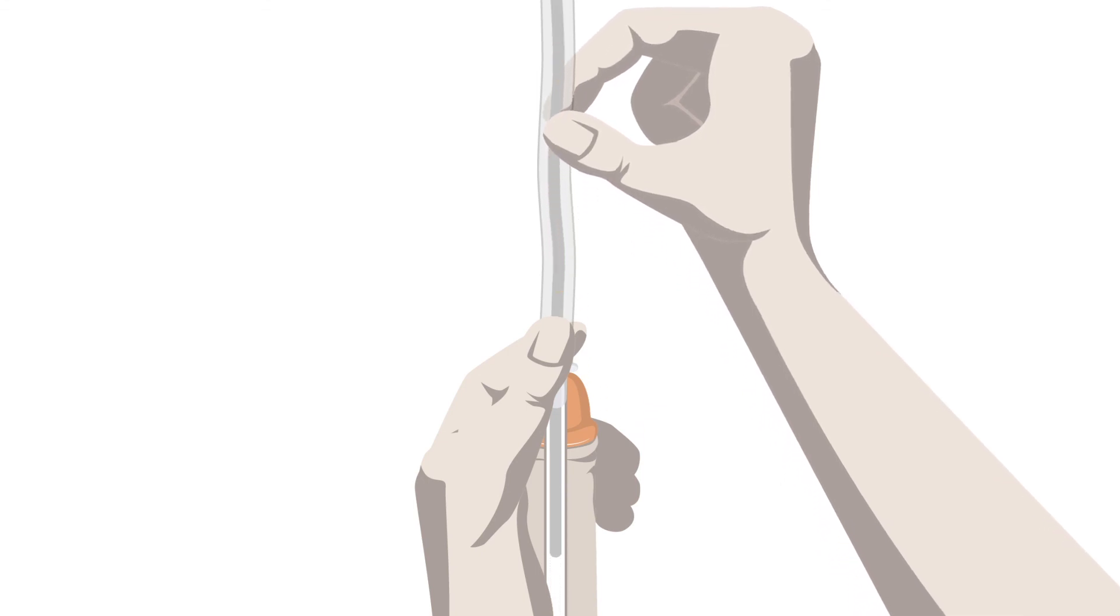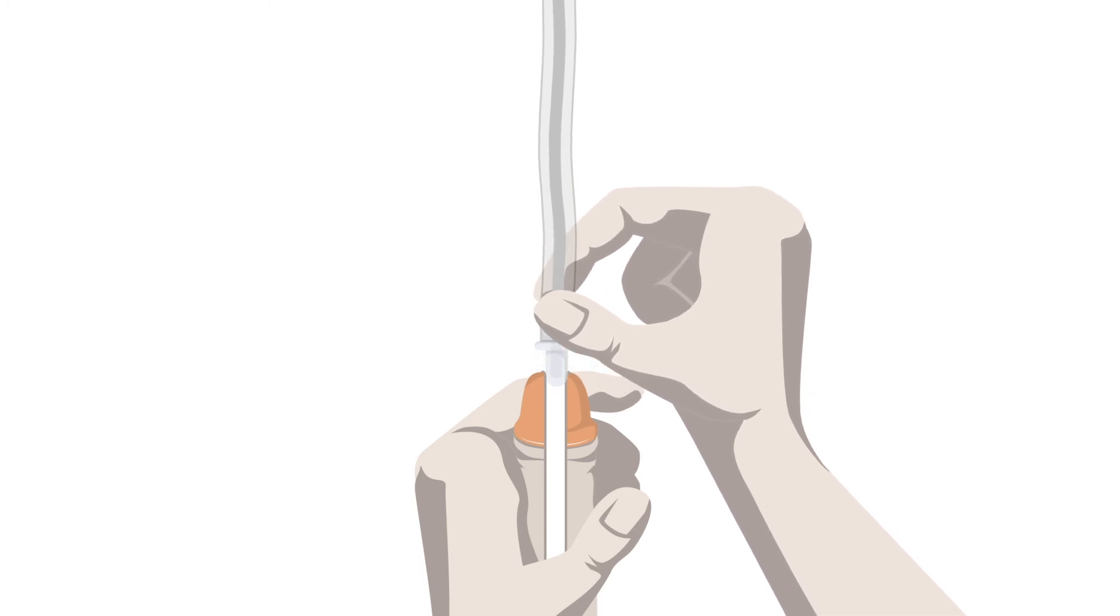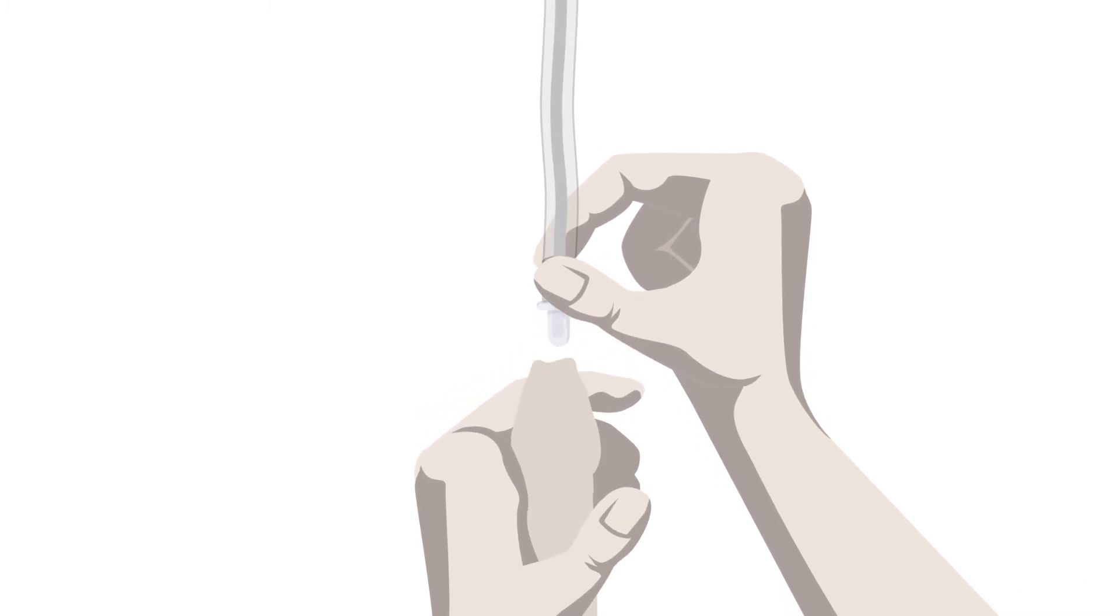you can slowly and gently withdraw the catheter, allowing for any pockets of urine at the base of the bladder to drain. When there is no further flow of urine, remove the catheter and then replace your foreskin, unless circumcised.